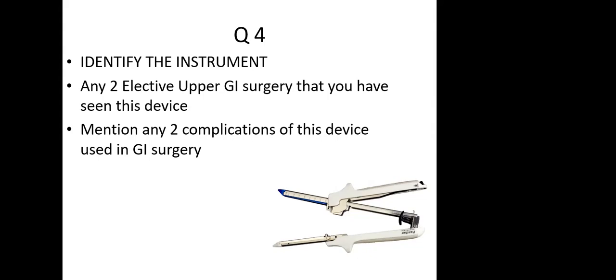Number two, there can be only a cutting that has happened on the mucosa, but there is no staple line formation, or there is a partial staple line formation. Number three, the most dangerous one that we all fear is the stapler getting stuck, and you cannot open the stapler. That's a bad one, but it can happen.